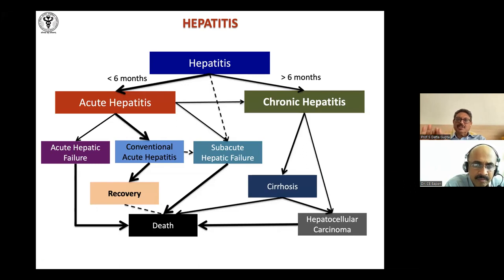Then, supposing you are suspecting Wilson's disease, you have to do copper stains. You want to do hepatitis B surface antigen; nowadays, if it's HBV, we generally do immunohistochemistry for surface and core antigen. Others we don't do. If it is HCV, we generally don't do any. So H&E, diastase PAS, reticulin, and a collagen stain are done in all biopsies.